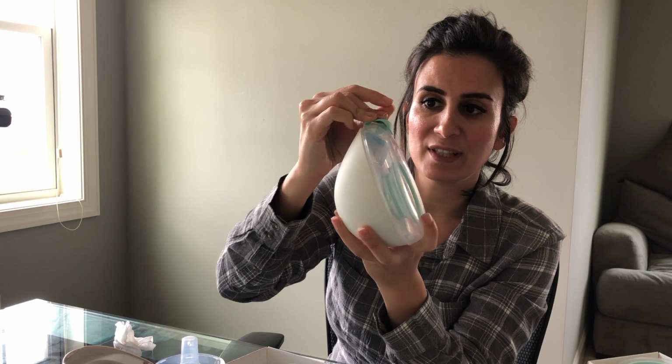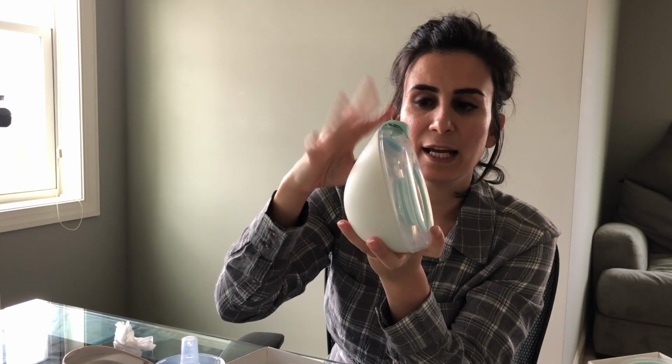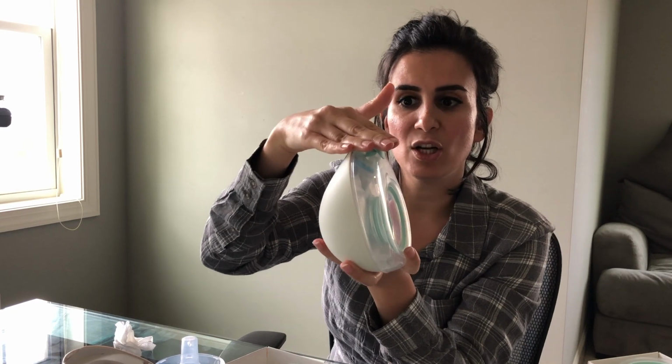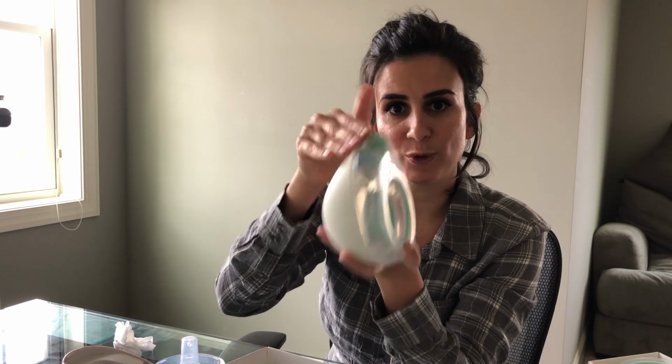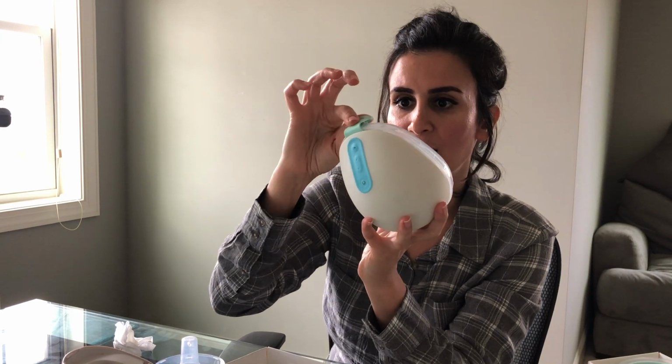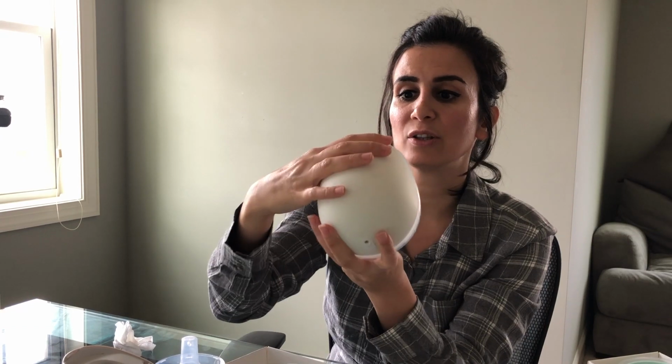And you'll see how there's a little flap. That flap needs to lay inside. I will make another video on troubleshooting the Willow container, and I will post that later. But yeah, I wanted to tell you that you have to make sure this is on correctly.